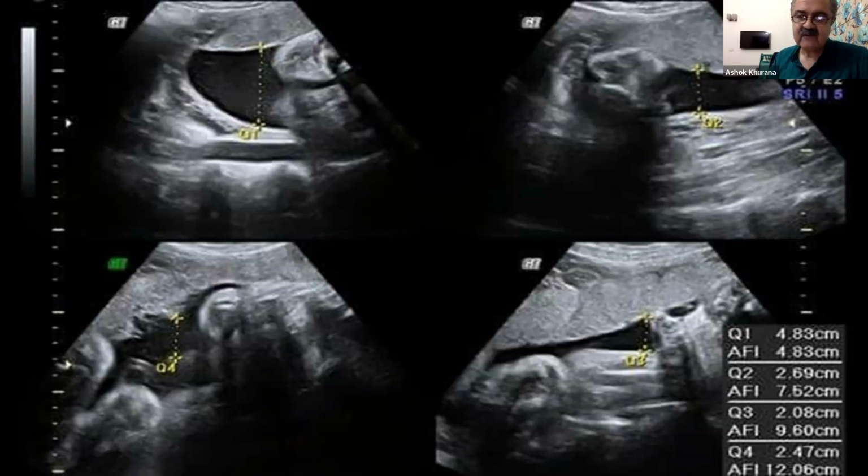What I like to do is make sure that I survey the whole uterus, check out all the pockets, and decide for myself subjectively what is going on. And for the purposes of comparison, I will always in singleton pregnancies do an amniotic fluid index.